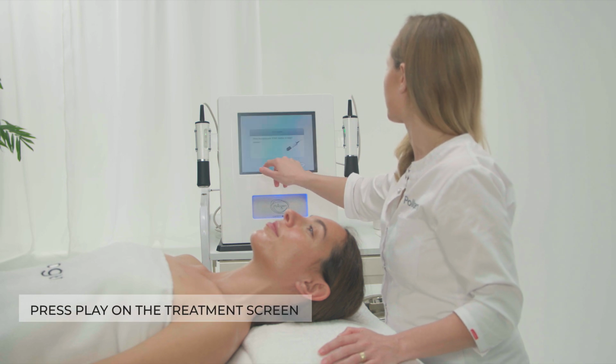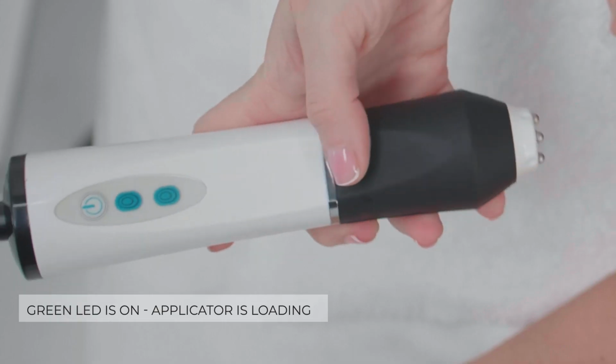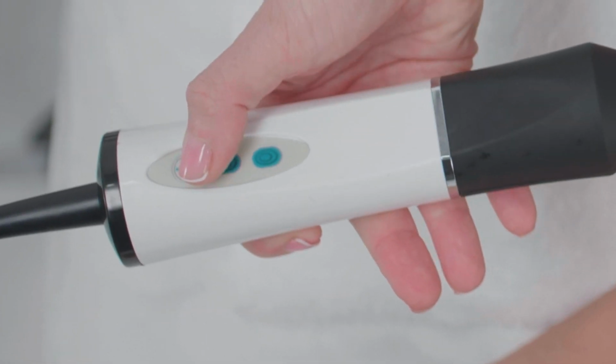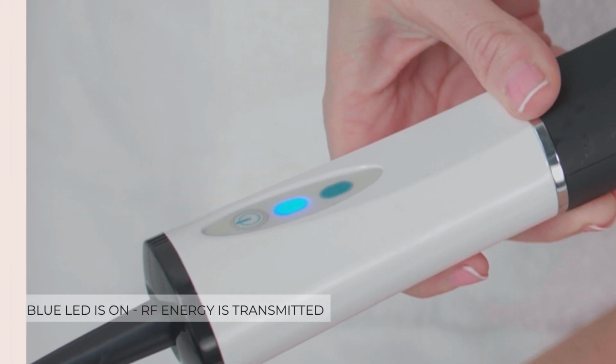Press play on the treatment screen. The green LED on the applicator starts blinking, indicating that the program is loading. To start treatment, press the Start button on the applicator. RF energy is transmitted to the electrodes, and the LED indicator light turns blue.